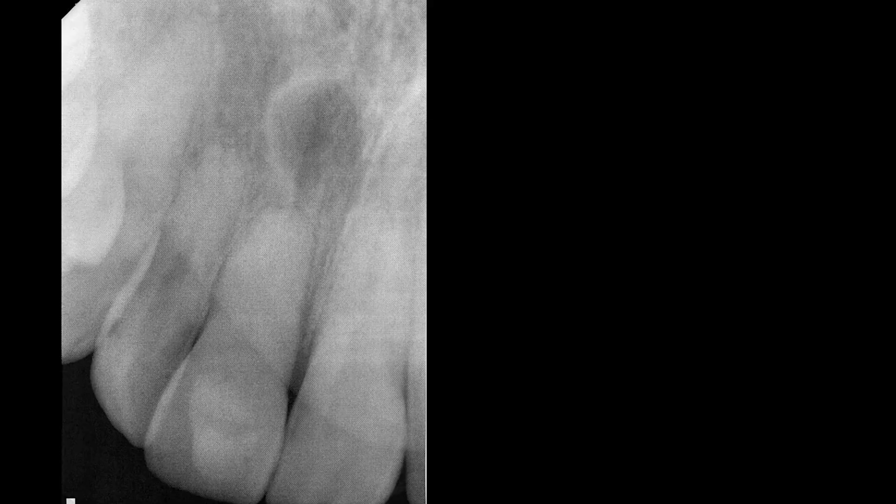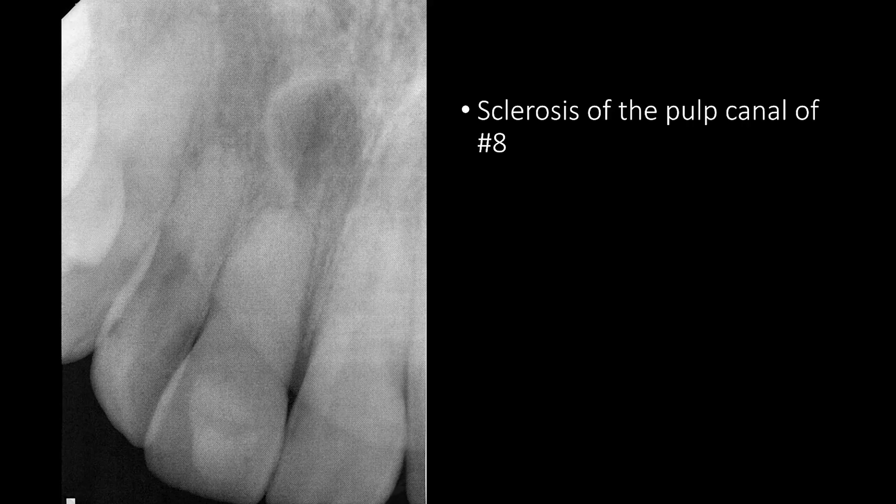So with the history of trauma, sclerosis of the pulp canal, and radiolucency near the apex of the right central incisor, the first choice in the differential diagnosis would be a radicular cyst. Because the central incisor had responded to the vitality test, it makes sense to obtain a periapical radiograph. The details of a tooth are much better on a periapical radiograph compared to a panoramic. On this periapical radiograph, we see sclerosis of the pulp canal of the central incisor — this is what we had seen on the panoramic radiograph.